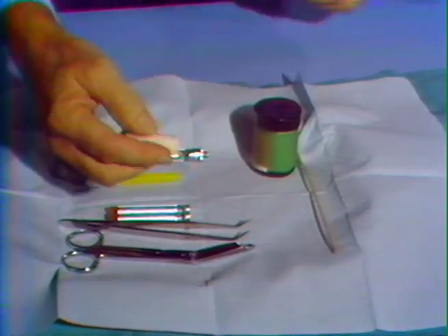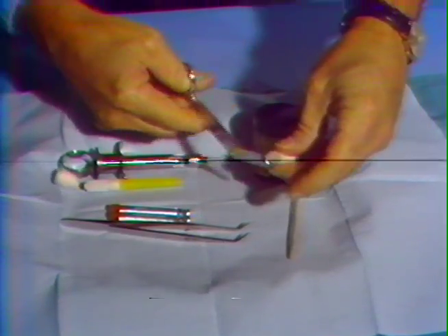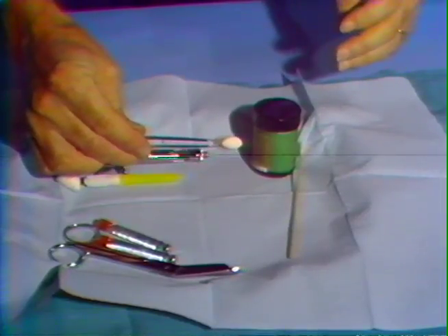For your clinical cases where local analgesia will be required, you will, by appropriate requisition forms, obtain the necessary materials for topical anesthetic placement. The topical anesthetic material, the syringe and needle, cotton pliers. The placement of topical anesthetics intraorally can be accomplished with dental cotton rolls or cotton tip applicators. A conventional dental cotton roll can be cut in half to make a convenient applicator. A standard dental cotton plier may be used as the cotton carrier.